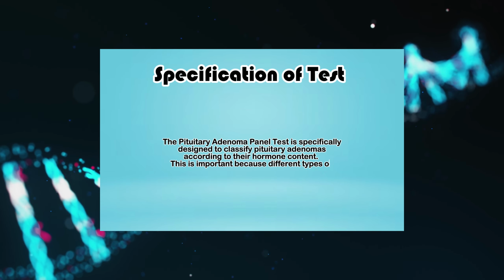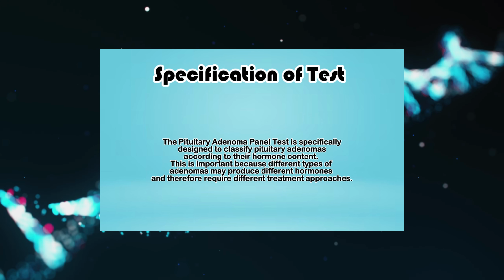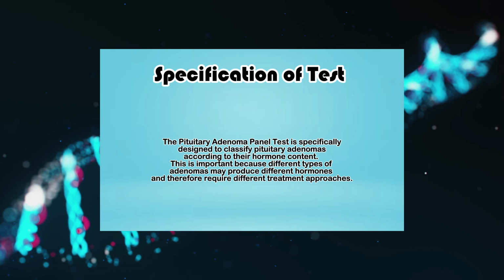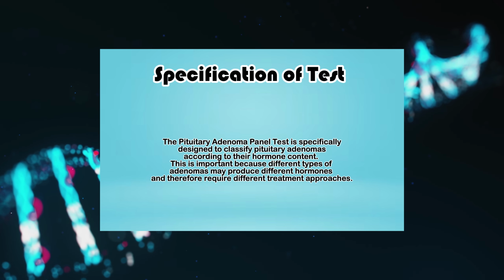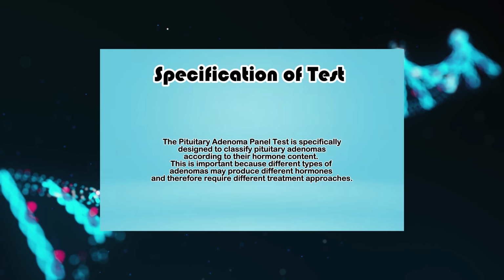The pituitary adenoma panel test is specifically designed to classify pituitary adenomas according to their hormone content. This is important because different types of adenomas may produce different hormones and therefore require different treatment approaches.